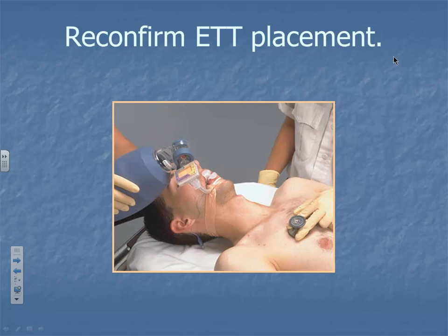Okay, if that tube is dislodged, who do they want to blame for it? You. So you want to check before you leave the ambulance, but once you move that patient over in the ER to their bed, you auscultate and you ask the nurse there, will you auscultate this? And then you document, rechecked, auscultated after moving the patient to the ER stretcher, confirmed by blank, and put their name on there. That is the CYA tip of the day. And it's a good one.